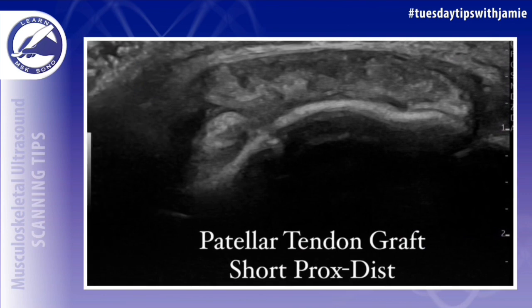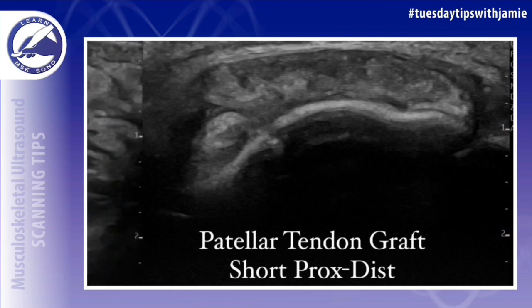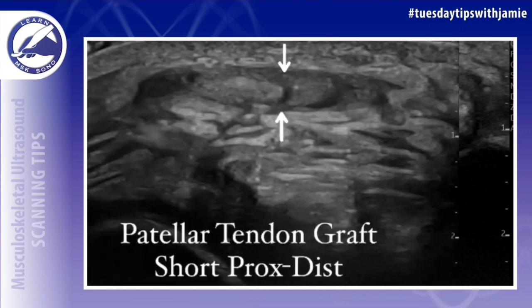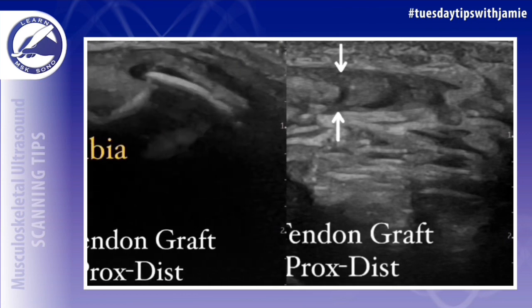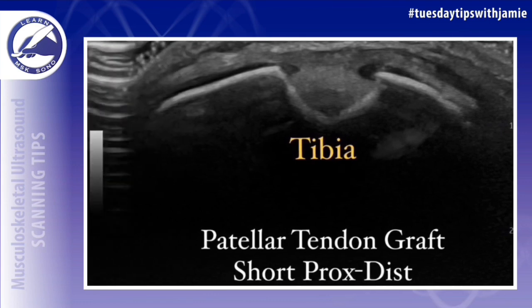Just to help you understand a little bit about what the procedure entails, when using the patellar tendon as an ACL graft, the surgeon removes the torn ACL and puts the new graft into the knee while making sure to line it up just like the original ligament. To make the graft, the surgeon removes a strip from the middle of the patellar tendon, which you could see on the arrows I put in the last image.